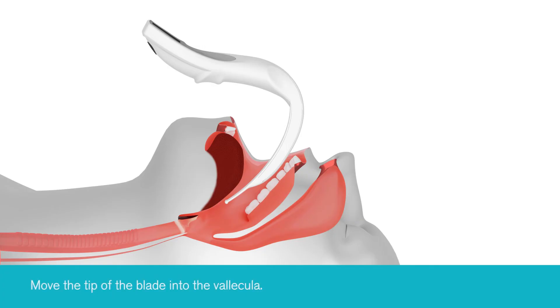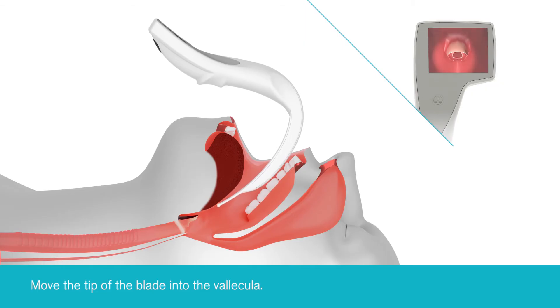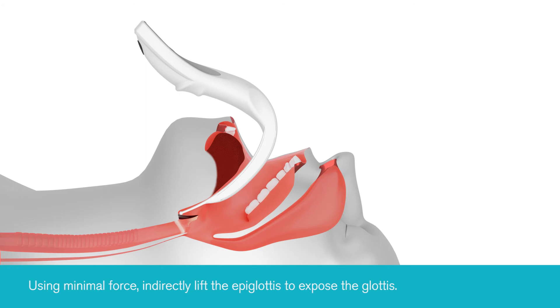The tip of the blade should then be advanced into the vallecula. With minimal force, indirectly lift the epiglottis with the iView until the glottis comes into view.